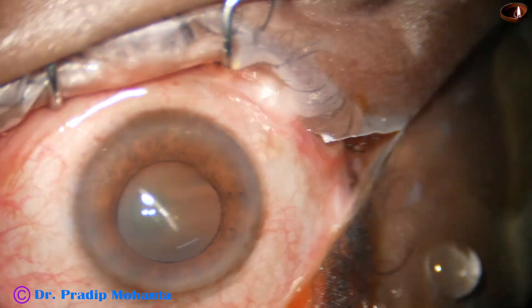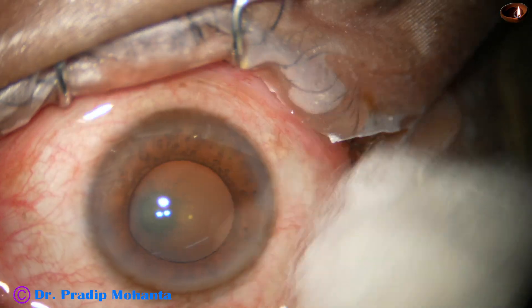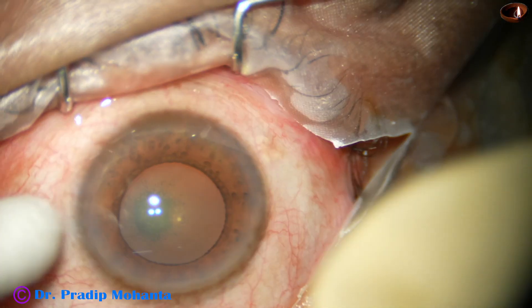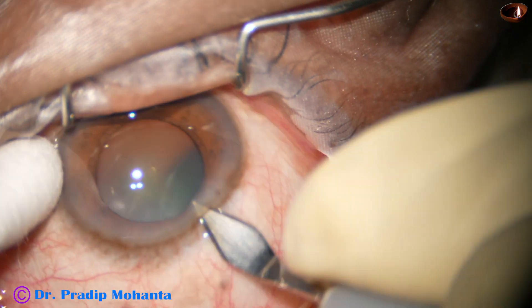We have started this surgery. The ocular surface is being thoroughly irrigated after applying a few drops of Betadine iodine. And now this is the main incision, with a 2.8 millimeter steel keratome.